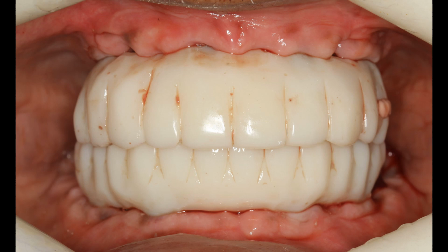Here are his upper and lower fixed temporary bridges. They are not the prettiest bridges I've ever made, but in his case we were trying to make them as strong as possible because of his intense grinding habit. So instead of doing white teeth with pink gums, I made the entire temporary out of my strongest crown and bridge temporary acrylic. I believe it performed better than any other option.